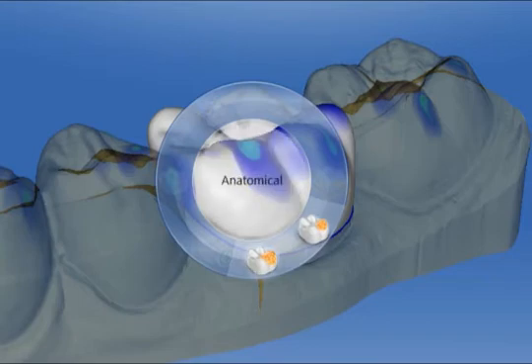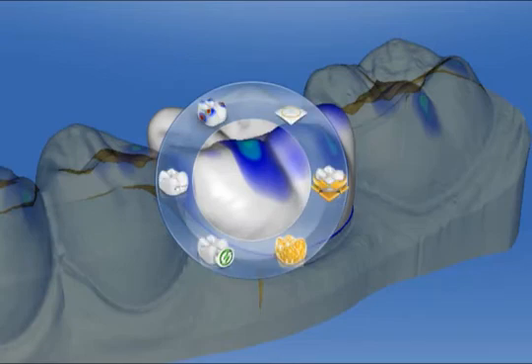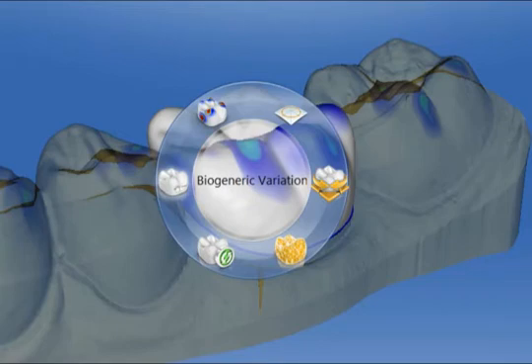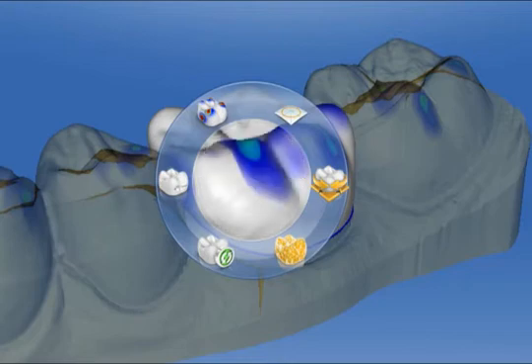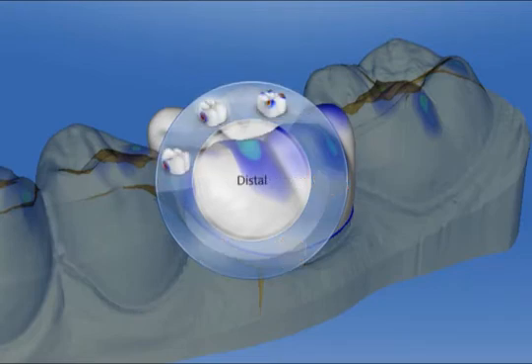On the left beside this is the Recalculate tool. Above this is the Biogeneric Variation tool that allows customization of the biogeneric morphology. Above this again is the Contact tool for distal, mesial, and occlusal modifications.